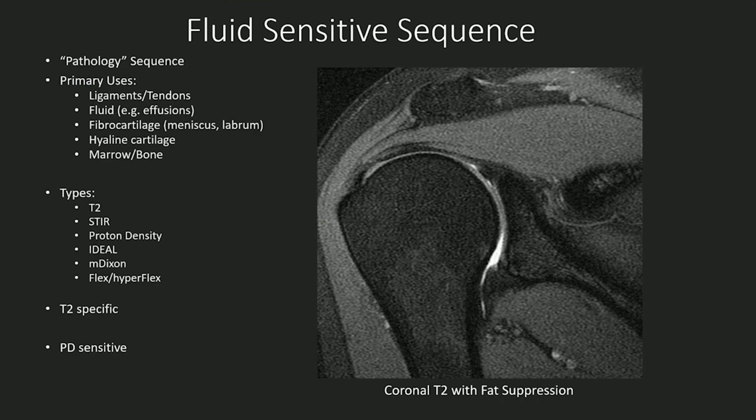And again, I don't want to take too much time on this question, but I think this is great for just understanding MRI and also using it to diagnose things. Tendons are dark on MRI. Doesn't matter the sequence, T1 or fluid sensitive. But when tendons tear, there's hemorrhage and edema that dissects through the site of the tear in the tendon. Fluid is bright on a fluid sensitive sequence, and hemorrhage and edema contain a lot of fluid. So, therefore, in a fluid sensitive sequence, the pathology in a tear will be bright. It's nice that the tendon in itself is dark on all sequences. So we get a bright pathologic finding of that fluid on a dark background of tendon, and we've created excellent soft tissue contrast to make that diagnosis.